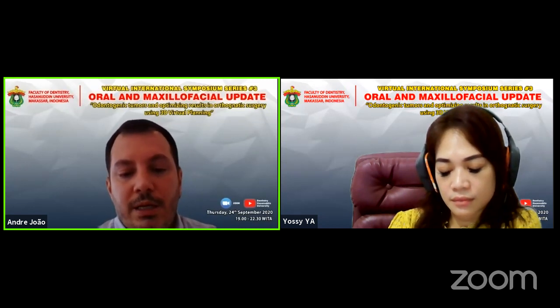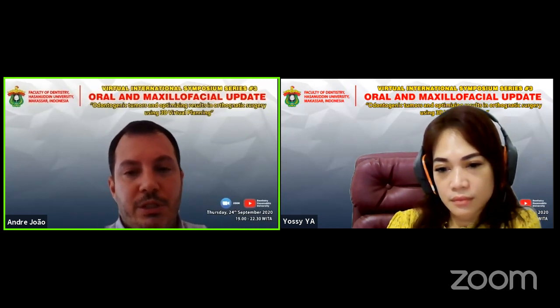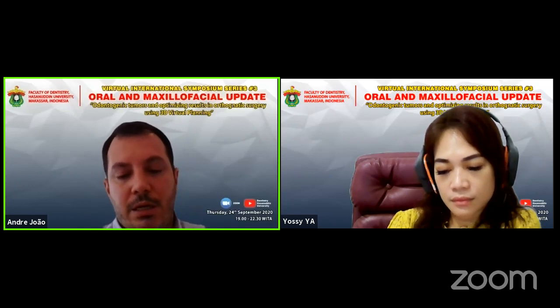And I don't know if you probably heard something about aligners, the clear aligners. While we are doing traditional orthodontics using braces, you place the braces in some position and then go to the wires.